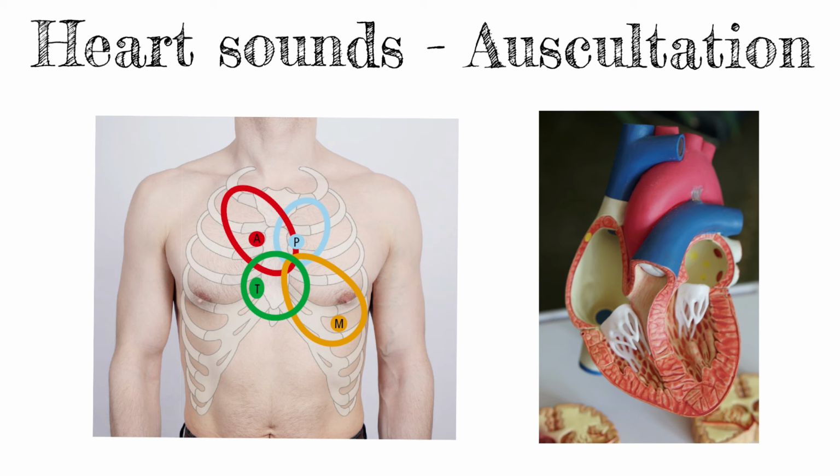And the reason for that is because the bell, they describe it as a resonating chamber, which is very good at amplifying very low pitched sounds. And we know that some of the pathologies that occur in the mitral valve are quite low pitched. So, for example, if you had a mitral stenosis, that would allow you to pick that up very quickly.